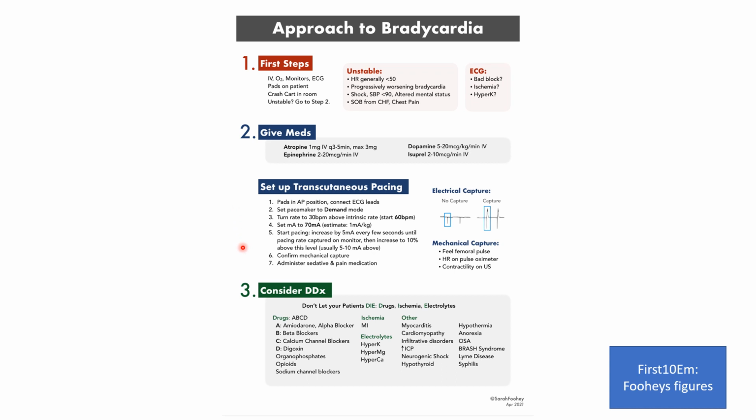I always like this area here, because it's not often that we do transcutaneous pacing, at least in my hospital. So it's good to know how to use your own pacer to get electrical capture and then mechanical capture. There are several YouTube videos on how to do this, and it's nice to familiarize yourself with your apparatus and how to do it in your department. Okay.